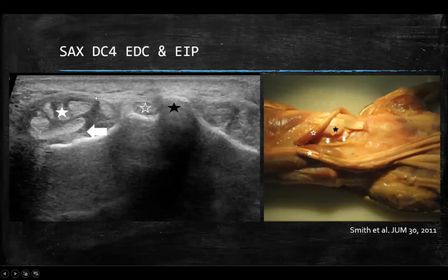This is a compartment where I think it's important to look at the thickness of the extensor retinaculum and also evaluate the tendons and the tendon sheaths for effusion. Gymnasts can have a problem here. Well, not only gymnasts, anyone that loads their wrist in extension can get a problem called dorsal retinacular impingement, where you might see a thickening of the retinaculum, usually more than 2 millimeters. You can see tendon changes or effusion, so that's a problem you might find in the fourth dorsal compartment.